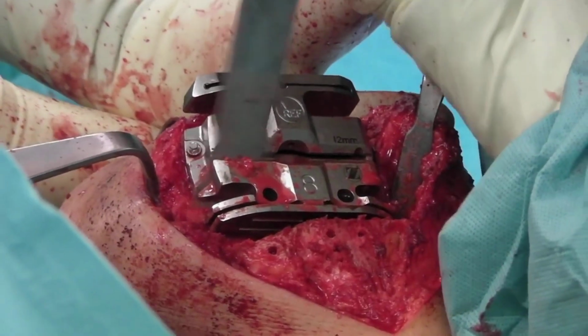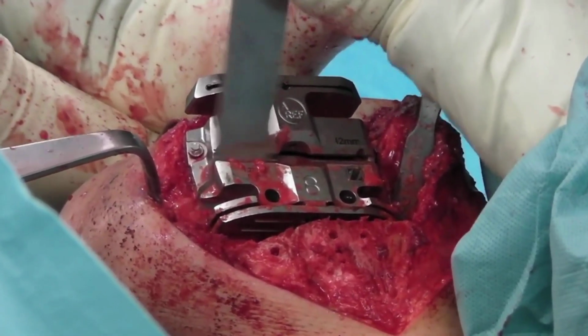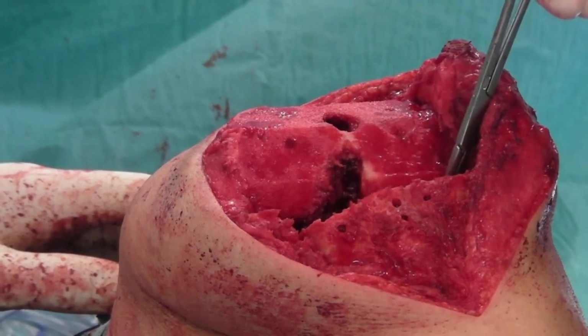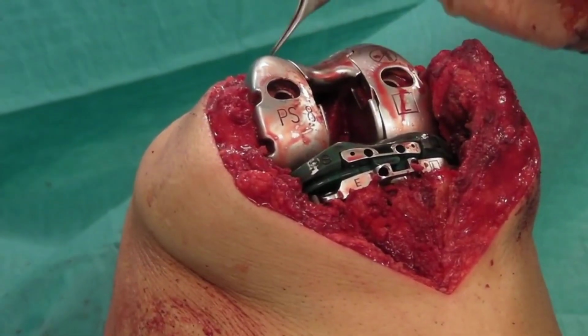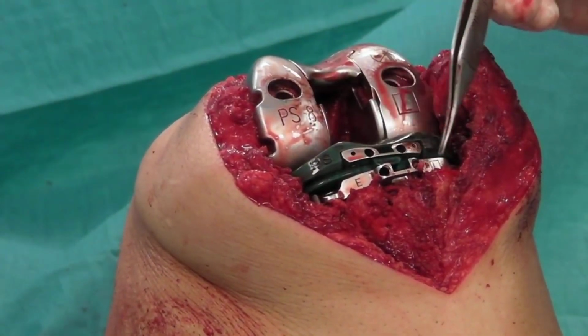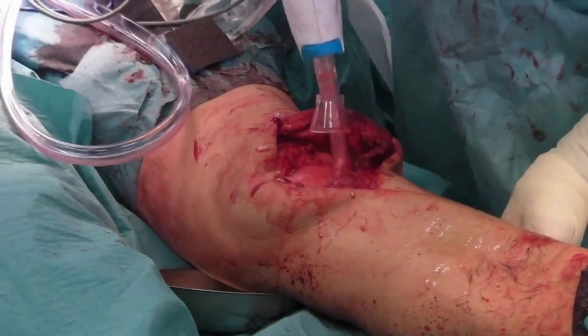Once this phase is complete, both the femur and tibia are ready to receive the prosthesis. Before implanting the final prosthesis, however, we must check the mobility and stability of the knee with temporary components. Let's now move on to the final stage.